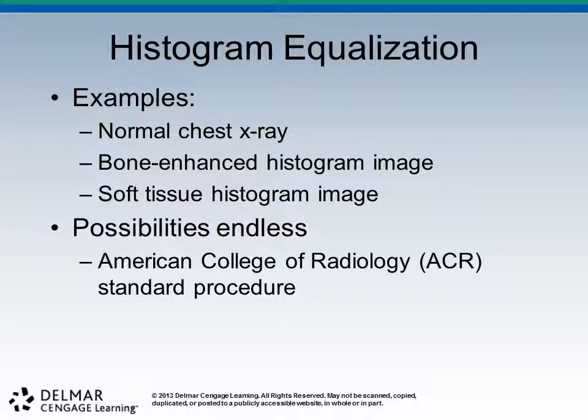All right. So some other things that we can do, man, is just about anything. It's akin to Photoshop. You can make anything look great. Here's what I would like for you all to do at some point. You don't have to do it tomorrow. Trot down to CT when you're not busy and ask him to show you a bone window of a skull. And then ask him to show you the soft tissue window of that same skull.